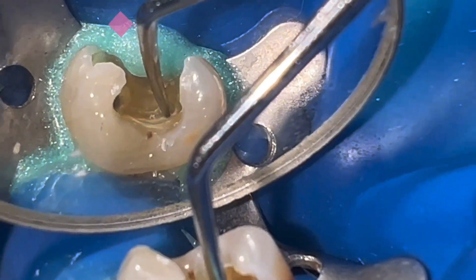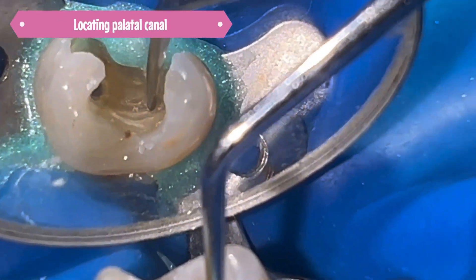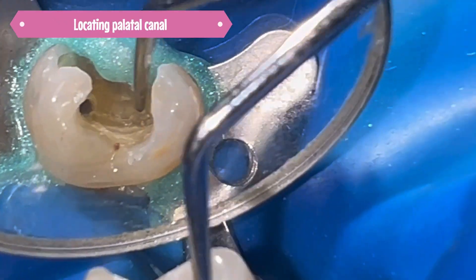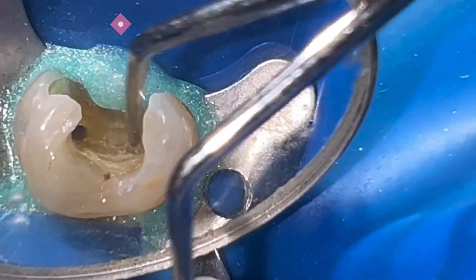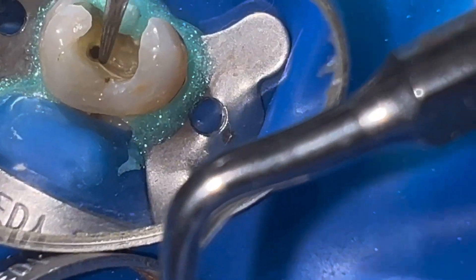Once I have completed the buccal canal, it's time to locate the palatal. First we try with an endodontic explorer but there's no trace of it — the file is spinning out of control.